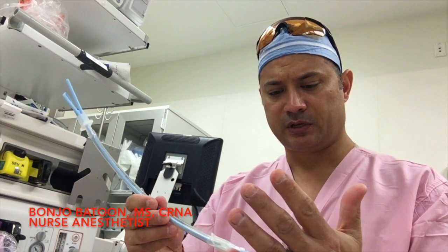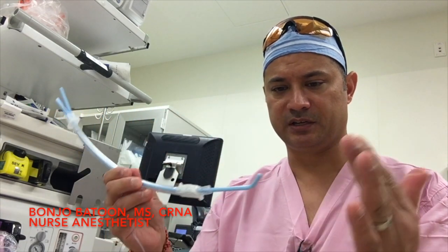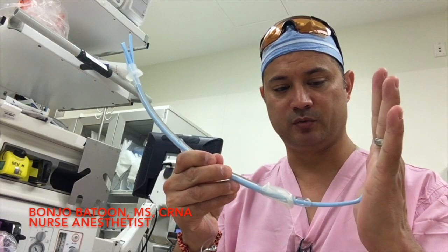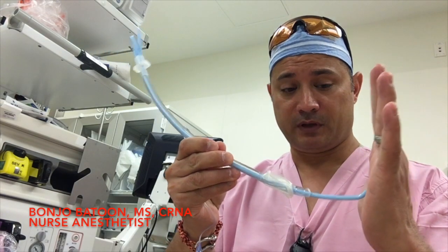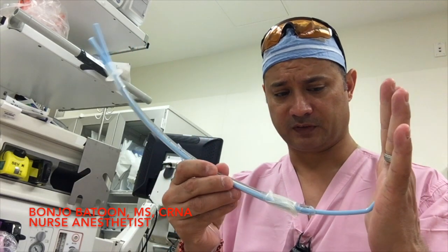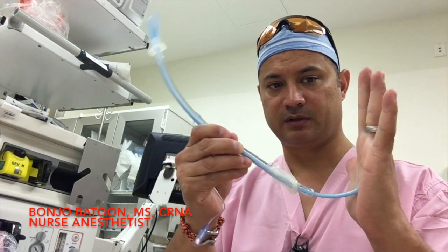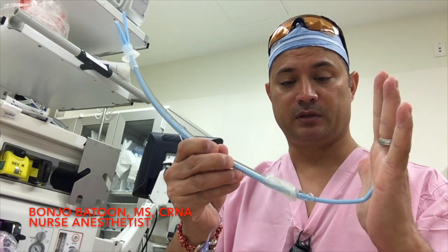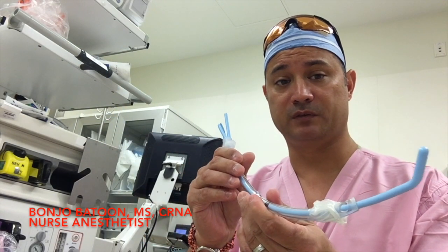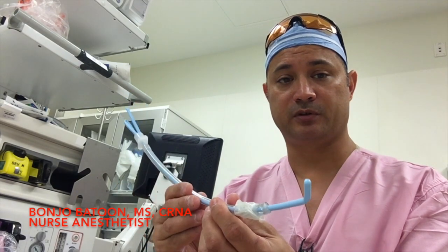The advantage of this versus using a preloaded bougie with no stabilization at the end is that if you touch structures, the ET tube will actually back out and you won't be able to get your flex guide into the glottic opening. So the benefit of this is to stabilize the bougie within the ET tube so you can actually get to the vocal cords and then pass your tube in one smooth motion. And it's a very natural thing for us to do.